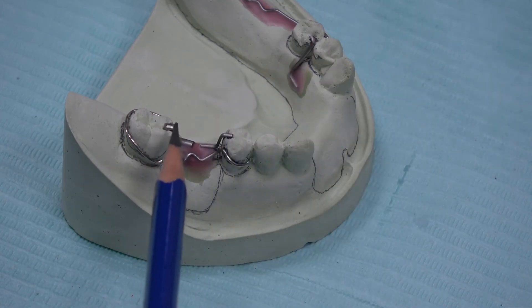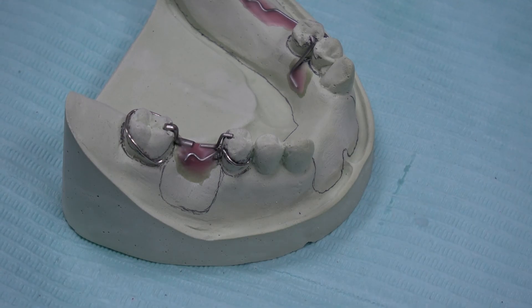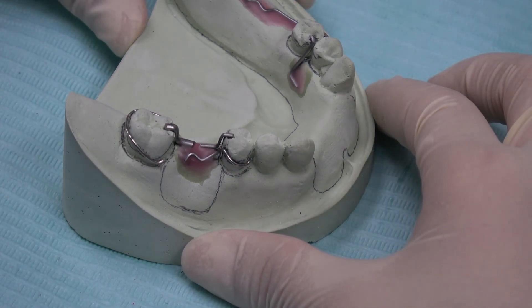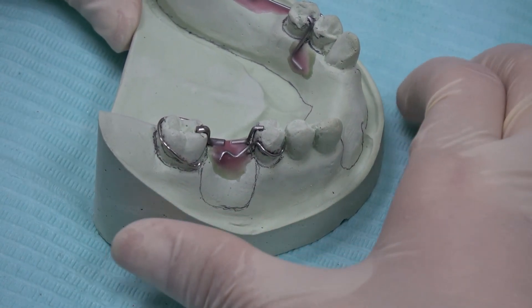Same concept applies to bend rest for the molar. And now this is a complete set — I have bent all the components and the rests.